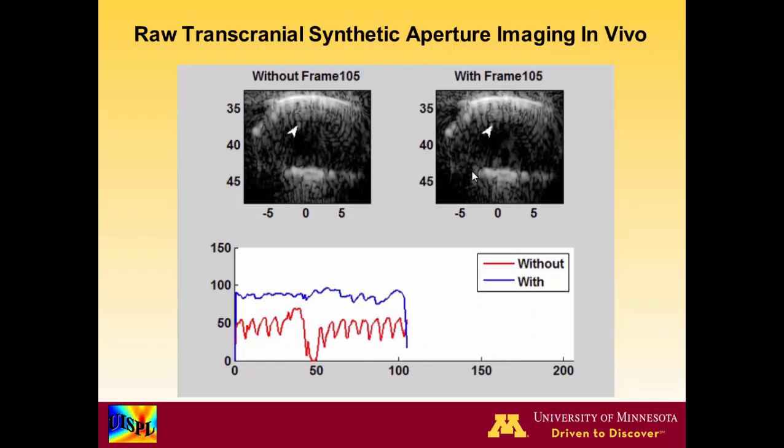Before the injection, as you could see here, the pattern is very periodic. You could see the pulsating and the breathing gasps. But after the injection, the pattern is very unpredictable. And another thing you should notice is that echogenicity is enhanced after the injection.